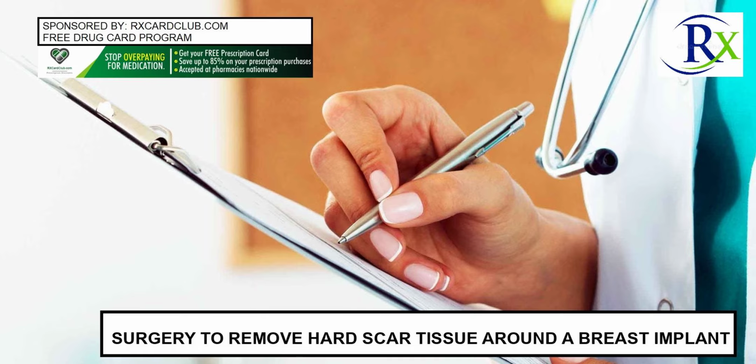A capsulectomy is done to treat capsular contracture, as well as for other reasons like implant rupture, infection, or cancer. It is considered the gold standard treatment for capsular contracture. The surgery involves making incisions, removing the capsule tissue, and usually replacing the implant. Potential risks include implant failure, recurrence of contracture, changes in breast appearance, and poor wound healing.